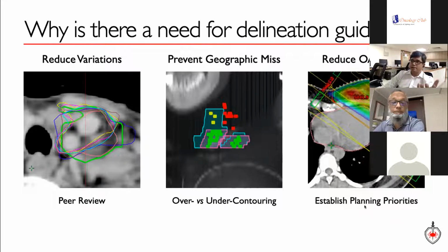In left breast cancer, which is ostensibly in today's day and age a curable disease, we don't want patients who are expected to live that long coming back after 10 years with radiation-induced heart disease. So we have to establish planning priorities. And the only way that we will do that is by undergoing rigorous peer review of our contouring, establishing a fine line between over-contouring and under-contouring. Under-contouring to reduce OAR doses and over-contouring to reduce recurrences.